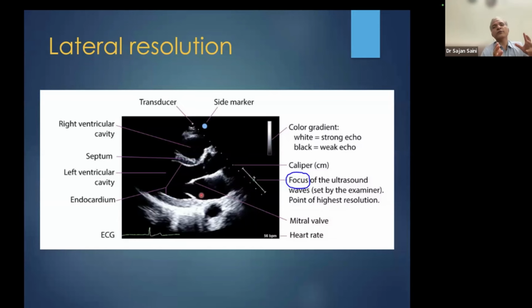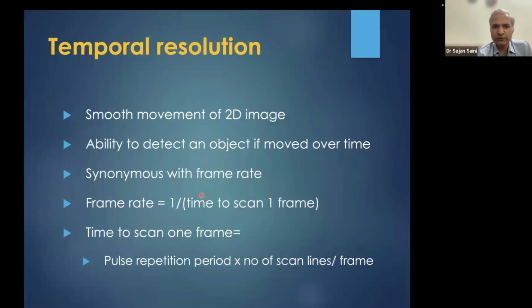So there are two ways to improve the lateral resolution, as said. The first is that you improve the frequency. With higher frequency, you improve lateral resolution. And the second is that you use the focus to improve your lateral resolution.